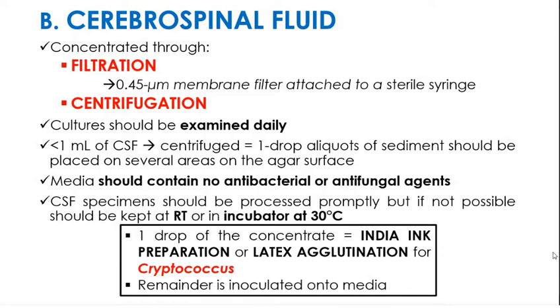And as it is, CSF should be processed promptly. Sabi natin, pag CSF, ASAP lagi yan. But if not possible, it should be kept at room temperature or incubator at 30 degrees centigrade.